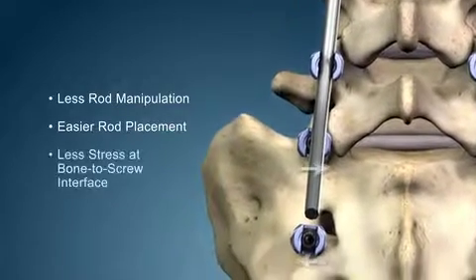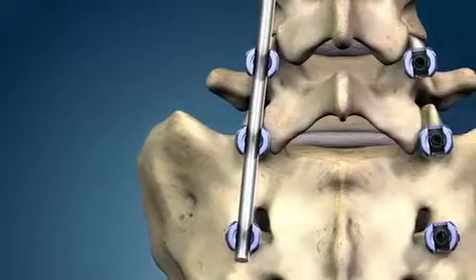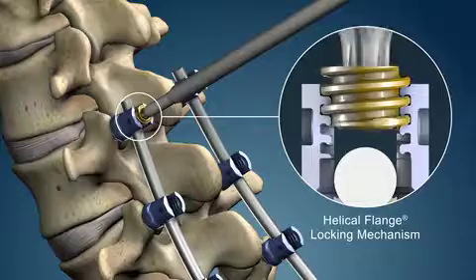Consequently, the load placed on the bone-to-screw interface may be minimized. The reliable helical flange plugs secure the construct.